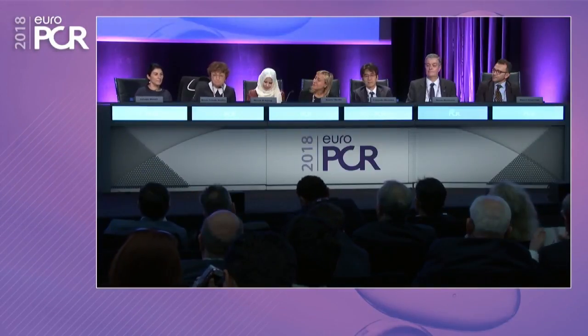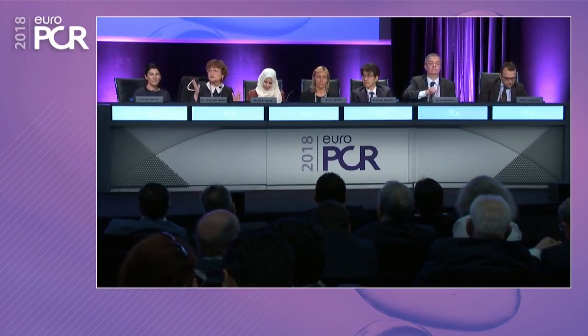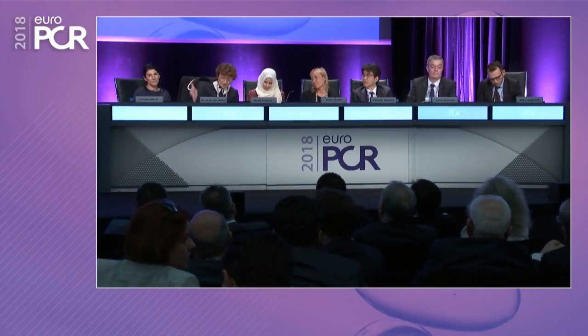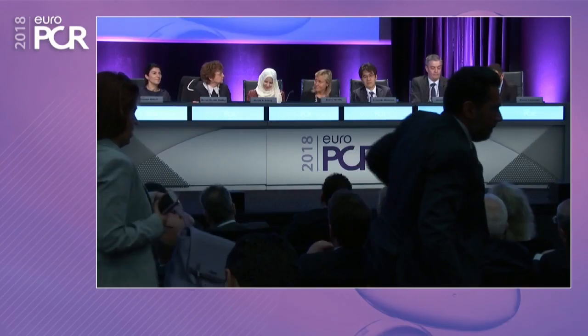What are the take-home messages from those two live cases? I have three. First, and completely unpredictable before this session, the story of the hidden diagonal. We have to do not too much, but enough to be sure that we don't miss a lesion.